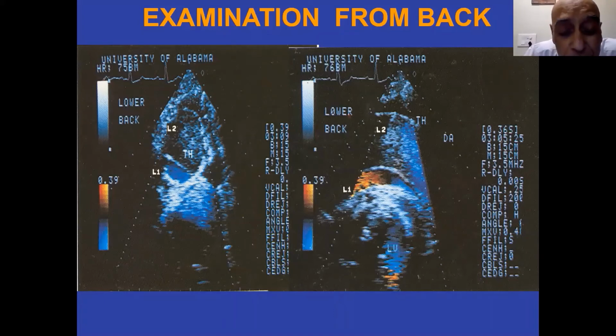The base will be the coronary sinus, and resting on that will be the left ventricle and the right ventricle. So that is the biventricular view. It is a very useful view, as I said, to look at the diaphragmatic wall of the right ventricle and to look at the basal infraseptal area of the ventricular septum to diagnose the post-myocardial infarction VSD after inferior wall MI.